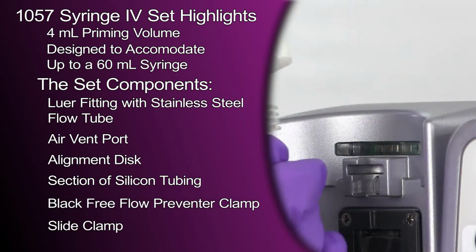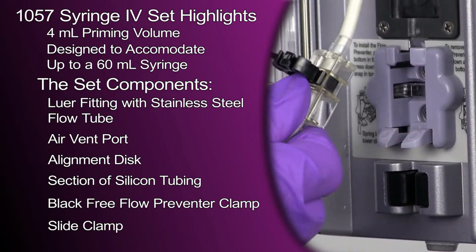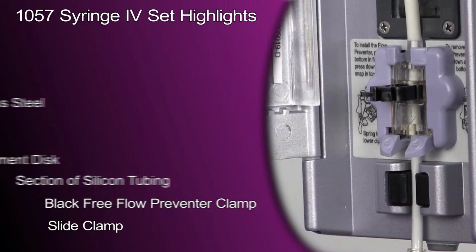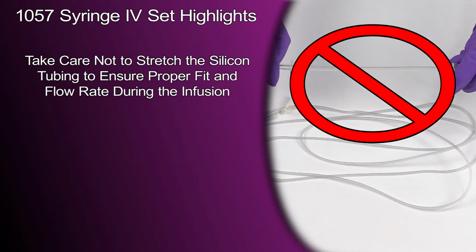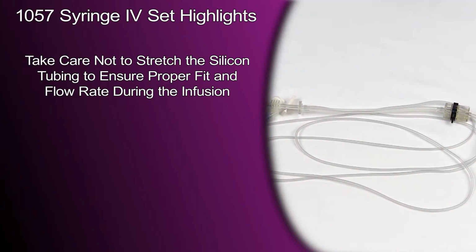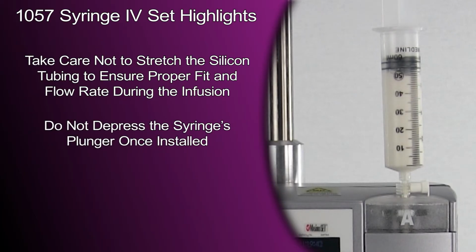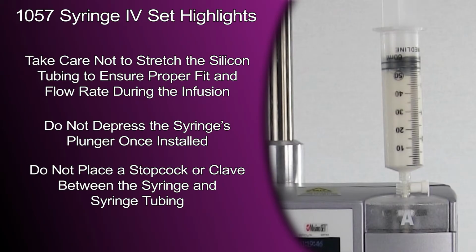The 1057 syringe adapter set has been manufactured with specific measurements designed to allow for a precise fit within the IV pump chamber. When handling the IV set, take care not to stretch the silicone tubing incorporated within the IV set, so as to ensure proper fit and flow rate during an infusion. When the infusion is in progress, the syringe's plunger will not, nor needs to be, depressed. Additionally, do not place a stopcock or clave between the syringe and the syringe tubing.